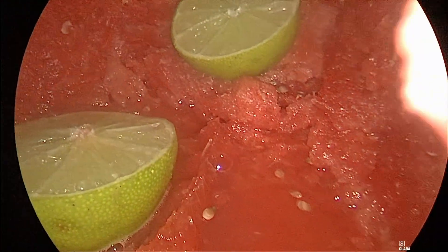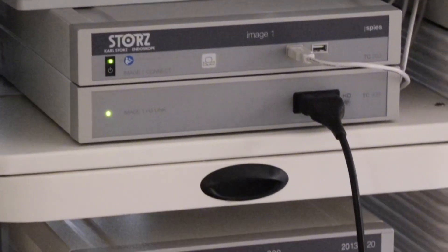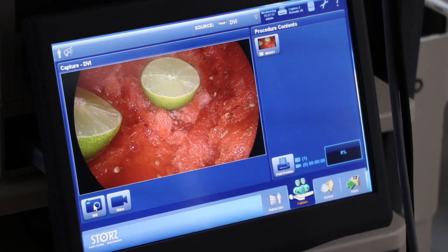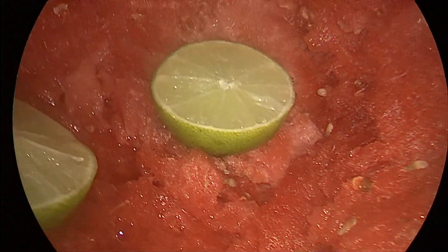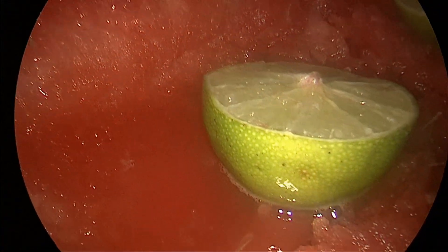The TC200 is the Image One Connect and serves as the processor for the platform. The Connect module may be used with up to three LINK modules. The TC301 is the Image One X-Link and is the LINK module for use with flexible video endoscopies and one-chip camera heads. The TC300 is the Image One S-H3 LINK and is the LINK module for use with Image One full HD 3-chip camera heads.